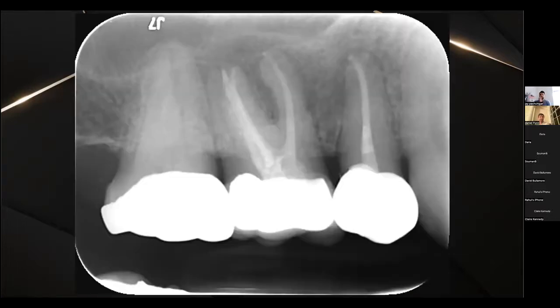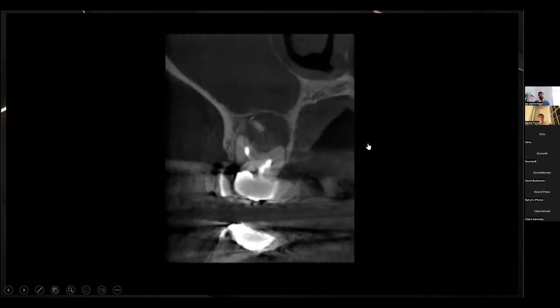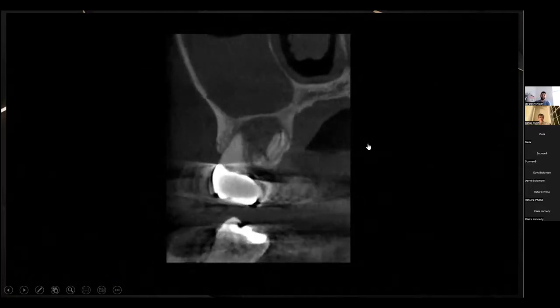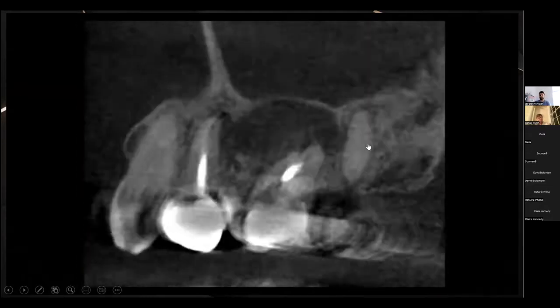So this is again a pretty interesting case where we're retreating that 1/6. Radiographically, it's not a bad root canal, but again, that's just from the radiograph. It's very difficult to know what went on during the actual treatment. So when we took a CBCT, it's quite evident straight away that the MB2 was missed, which is just this area to the right of the MB1. And again, the lesion is very big, probably a bit bigger than seen on the radiograph. So for a case like this, you've got some resorption there on the palatal root.